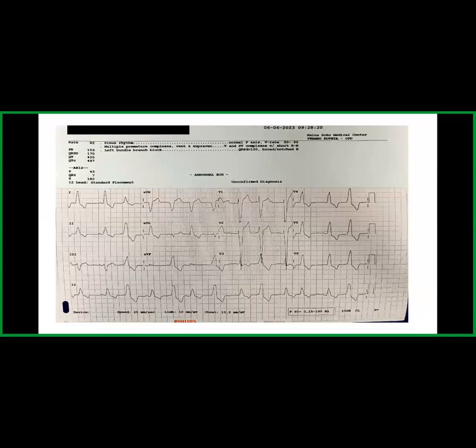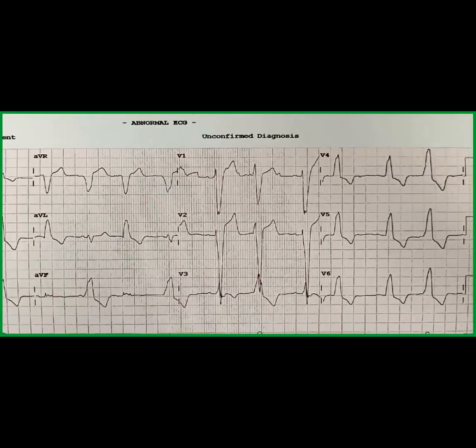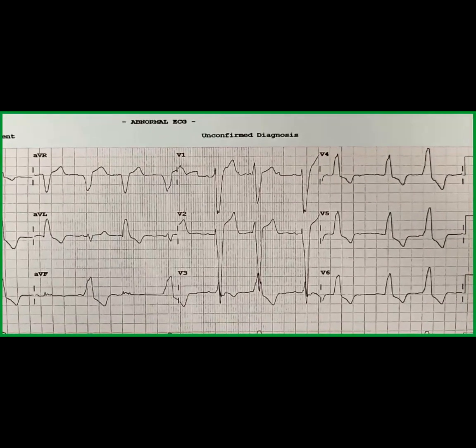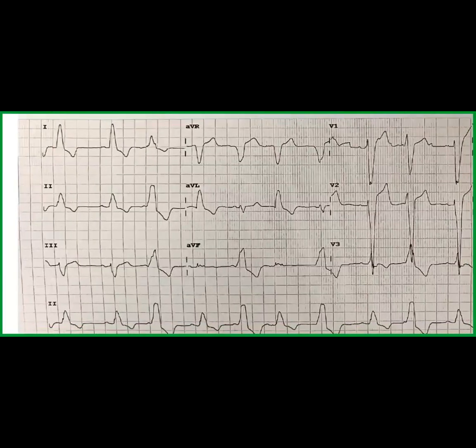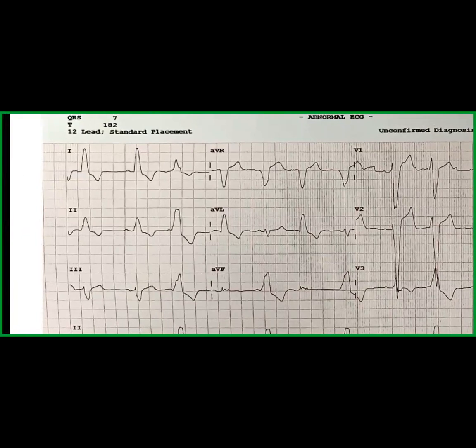Another example of a left bundle branch block here, we are able to see some of the criteria that I mentioned: a dominant S wave in V1, a wide QRS complex as we see in most of our leads here. We are also able to appreciate a monophasic or M-shaped R wave in our lateral leads.